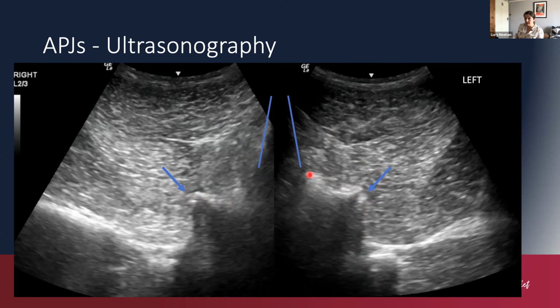This is perfectly normal. There's often a slight lip here. There's often a slight, it's called a mammillary process. You often get a slight spur on the edge of the articulation, and it's perfectly normal. And then we have our transverse process here horizontally. So this is a normal horse. It's a very easy technique to do. You just go from cranial to caudal, looking for these, I call them chairs when I'm teaching the interns how to do this, looking for these chair structures and then assessing the margins of that. I like to do them this way.